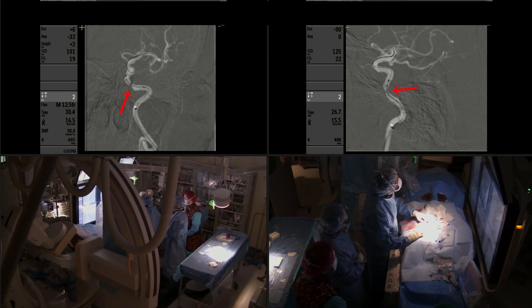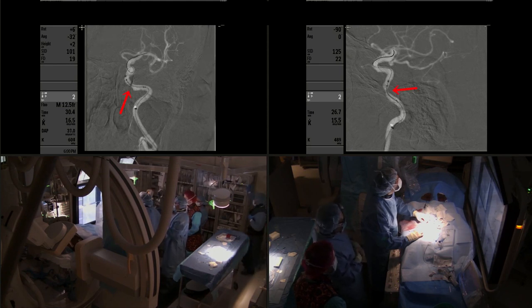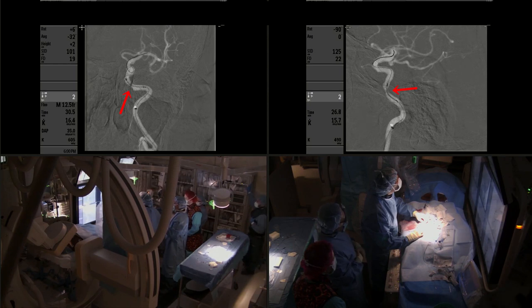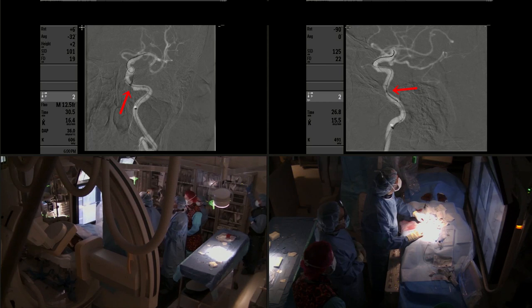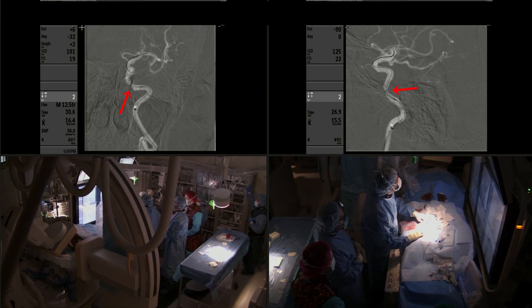Now we have the stent delivery system in place and we are unsheathing. We are not pushing the stent — we are just unsheathing the stent. You can see how the distal struts are already out, and now the stent is deployed.